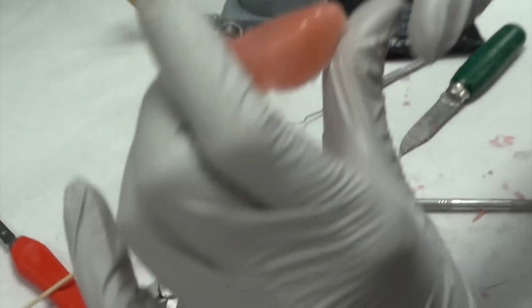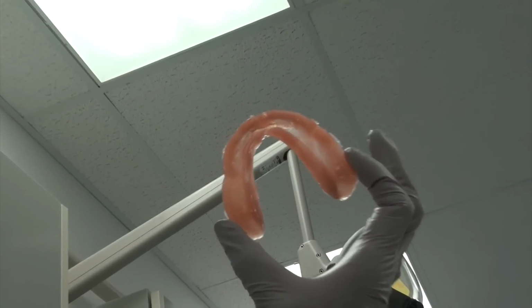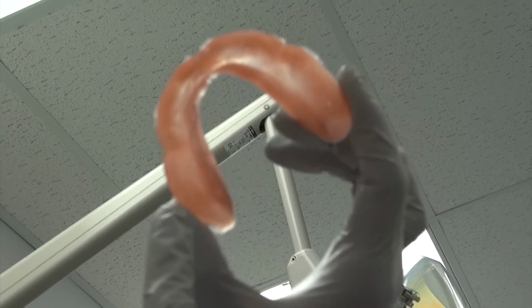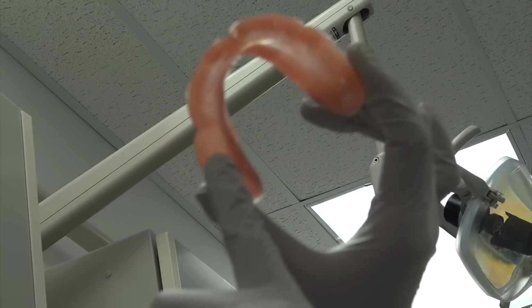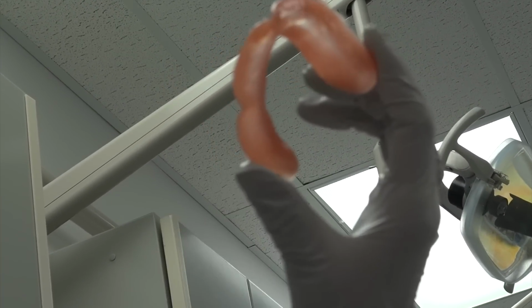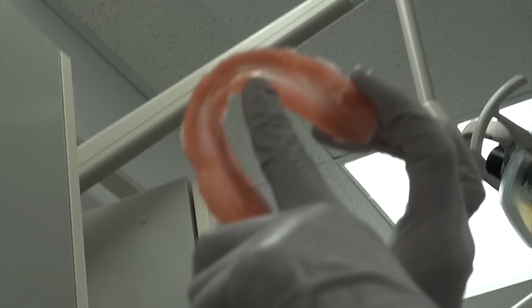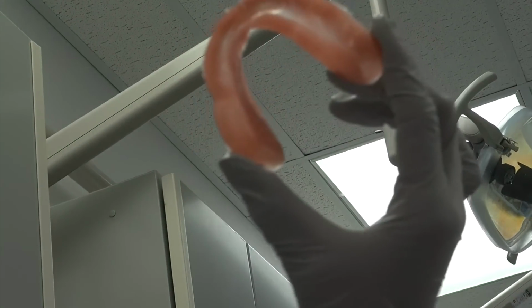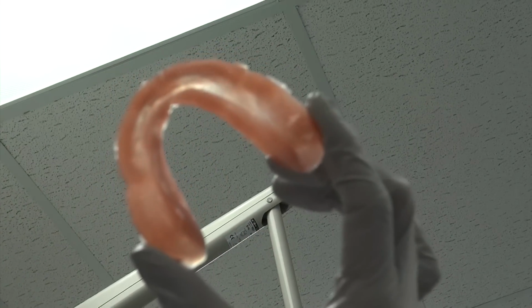perfect example of, now bring up the camera to the light. Can you see the different colorations? Now I did that on purpose for this example so that way I could show you what a thicker color was. So that's a little too thick. This is going to be closer to what you're wanting. Here is way too thin. Again, closer to what you're aiming for. Can you see those differences? Is it coming out?